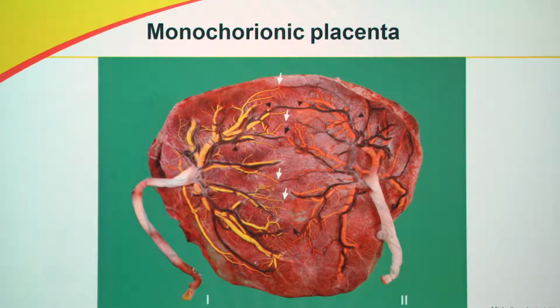The treatment for twin-to-twin transfusion syndrome all over the world is standardized: laser photocoagulation of the intertwin anastomosis. So how do we do that? We go in with the scope and burn these anastomotic points and then connect the dots between the points and separate both babies on the placental surface, which causes complete dichorionization. This method is also called the Solomon technique in the literature.